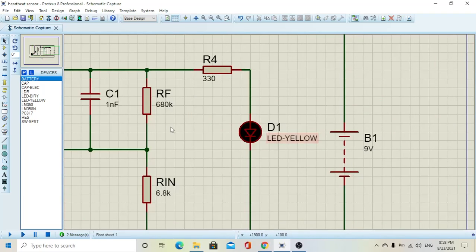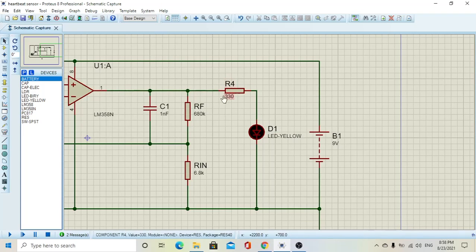Right here we have the LED connected to the output of the amplifier. We have connected a 330-ohm resistance to lower the voltage coming out from the amplifier, because the maximum voltage from the amplifier is nine volts since we supply it with nine volts. So we use this resistor to give the LED approximately 2.2 volts across its pins.